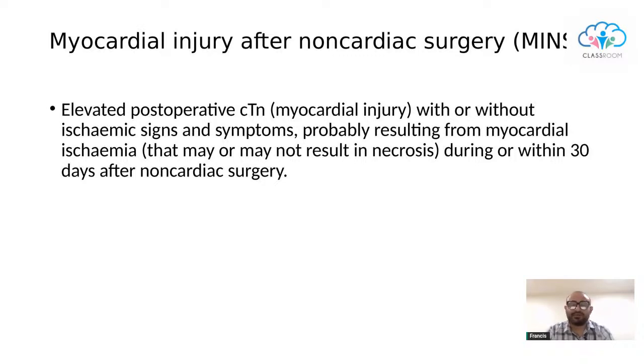What has been found in all kinds of surgical patients, including neurosurgery patients, is elevated post-operative troponin with or without ischemic signs and symptoms. These patients are generally on opioids and may not exhibit symptoms. And these patients can have elevated post-op troponin because of myocardial injury during the first 30 days after any non-cardiac surgery. And therefore, in these patients, ECG monitoring is a must.